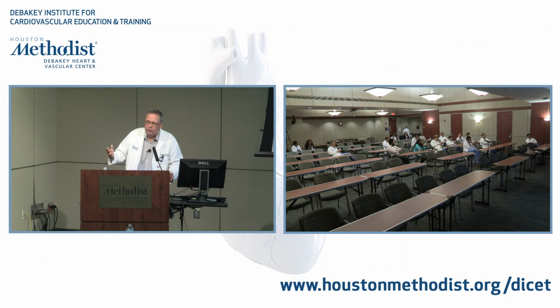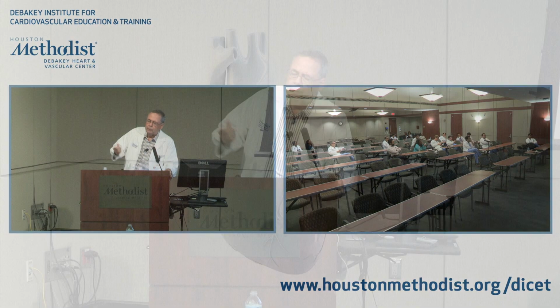Yes, that could be just as used. And in fact, 25 years ago, when people were on the bandwagon of trying to use echo for everything, there were papers written about that. If you catch the patient at the time of chest pain and you see a wall motion abnormality, you're golden. How often do we do that? So the reality, the practical value, it's really not for discussion. Okay.